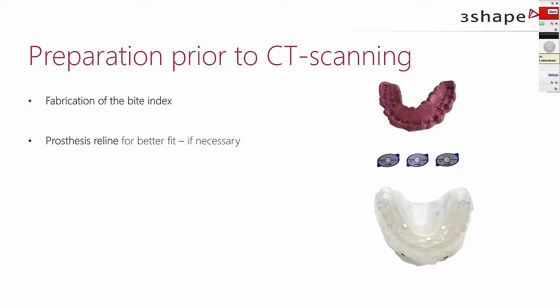Yeah, exactly. So moving on to the next thing we need to do in our preparation prior to CT scanning: if the existing appliance denture contains a metal frame or any metal in any of its parts, then we need to make an acrylic copy of this denture. We cannot have any metal in the denture that we want to scan. This will ruin the scan, and we will see a lot of metal artifact in the CT scanner. So we really stress that if you can make a copy in a hard acrylic material, there's no way around it.